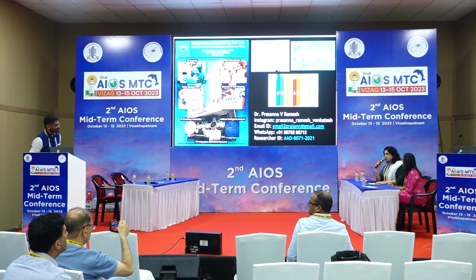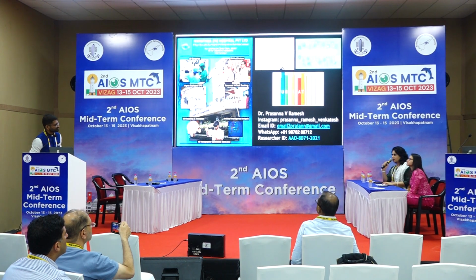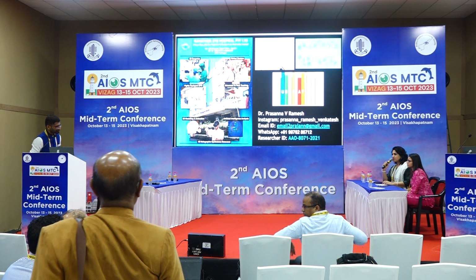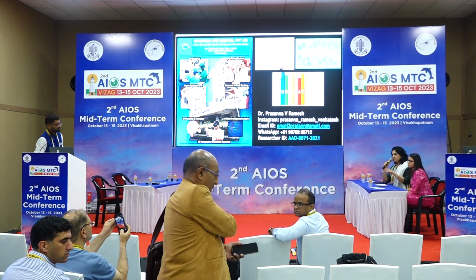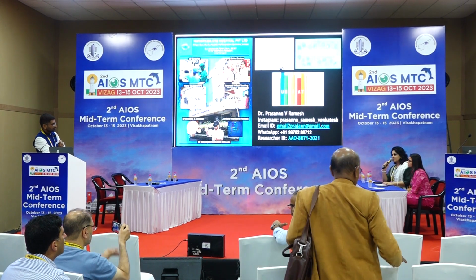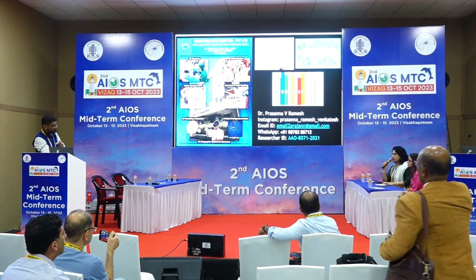Actually, one comment I would like to make: the ganglion cell complex is also something we need to look at. Even in early glaucoma, sometimes the GCC gets affected. So we advise 10-2 also these days, instead of just 24-2 as we have been doing in the past.